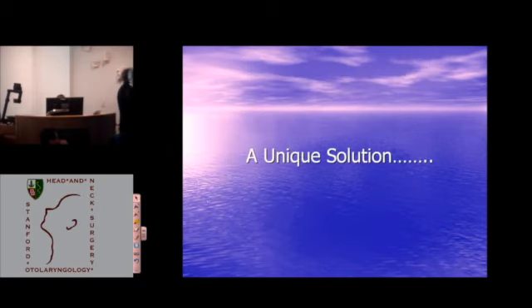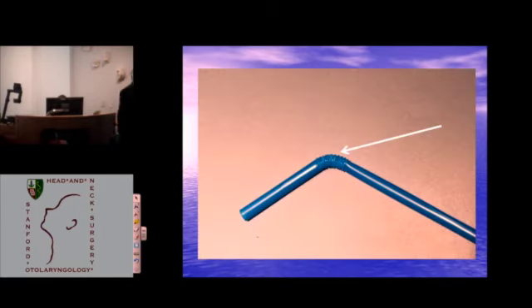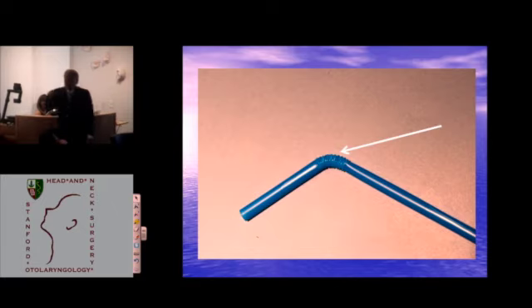Okay, next slide. And so the unique solution is a device that is like an accordion. And this is not a deep tract. People have said, oh, that's going to collect all kinds of mucus. I have put more voice prostheses in people than anybody on this planet. Trust me, that's not going to be a problem. Next slide. And where did the concept come from? One day I was sitting having lunch and there was a straw on the table. I looked at the straw and I looked at this portion, even though it's not elastomeric, and I thought, that's the solution. Isn't that prior art? Pardon? Yeah, it is, but only in drinking straws.